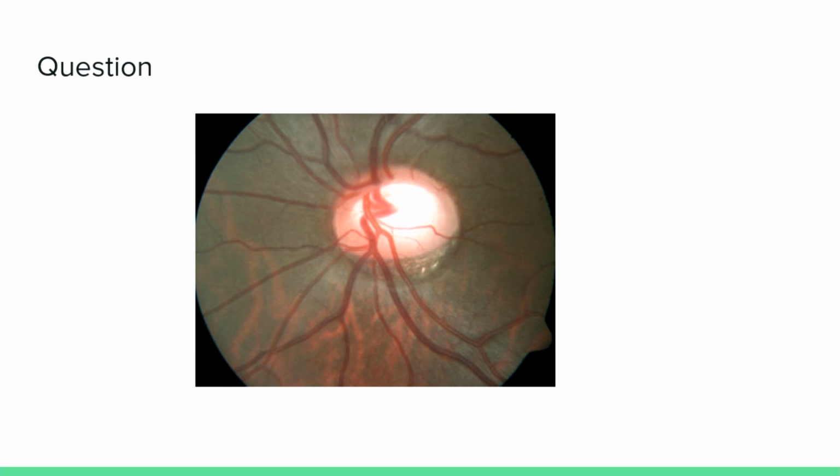You see, when they are taking the picture, the upper margins are very well defined, like you said, and the lower ones are blurred, right? So that means the position of the inferior rim is not at the same plane as the superior one. So there could be a small tilt anterior-posteriorly. So that could be the reason why you are seeing something like this. So you cannot really comment on the inferior rim that much. You can say that it may be looking sloping or tilted. That's all. It's a difficult disc to comment upon, but the rest of the things you can say. Yes, sir.